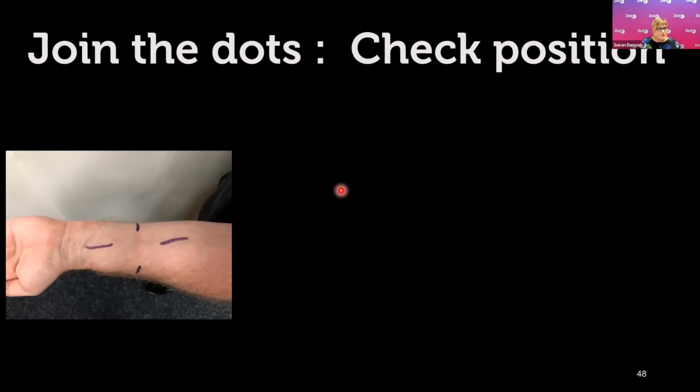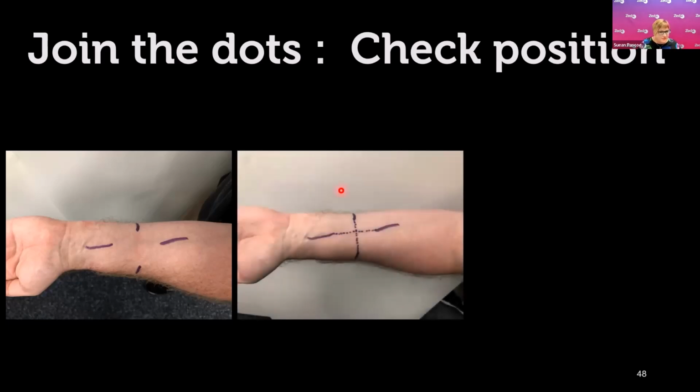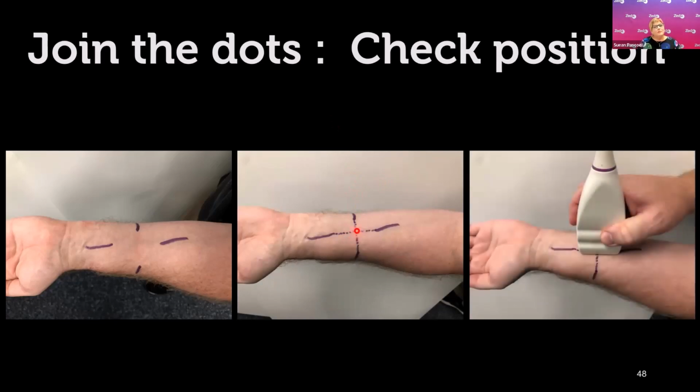So once I've got this sort of geolocated, I then join the dots, and that means that my foreign body should be right under the X marks the spot here. But rescan again and check to be sure. It's much easier to sort it out, wipe off the gel and reposition it here than it is to be cutting down on the wrong spot and fishing around forever. So that's kind of how we go about doing the scan and marking the spot.